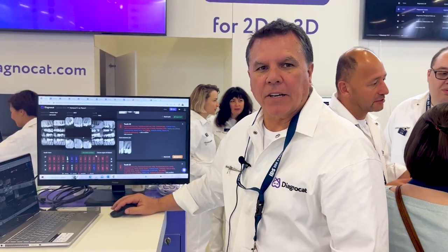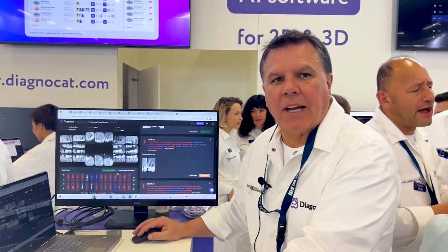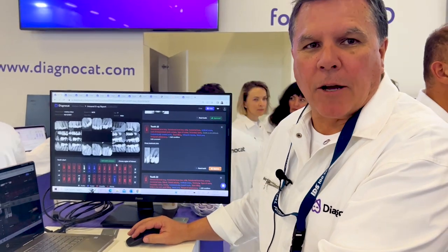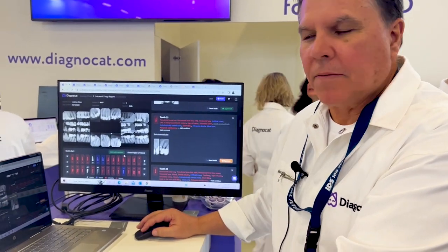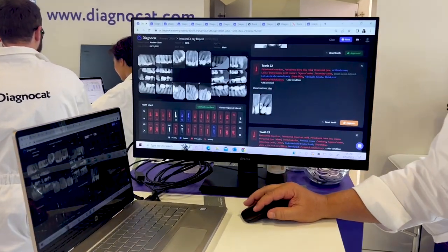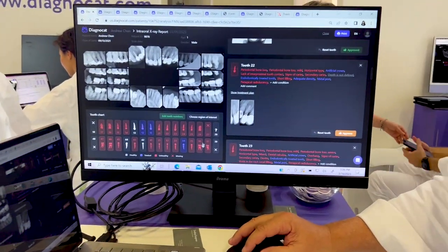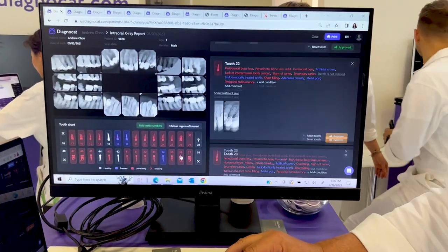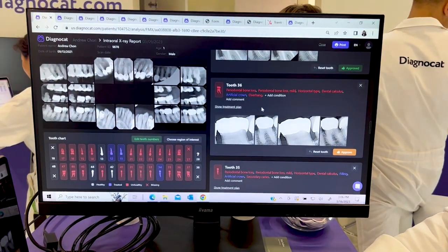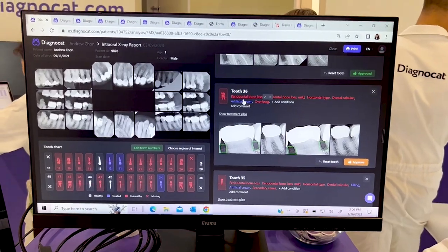Here's what Diagnacat can do. It's AI software, cloud-based software. As you can see here we have a full-mouth series. Click on the tooth number and you have your diagnosis by Diagnacat.